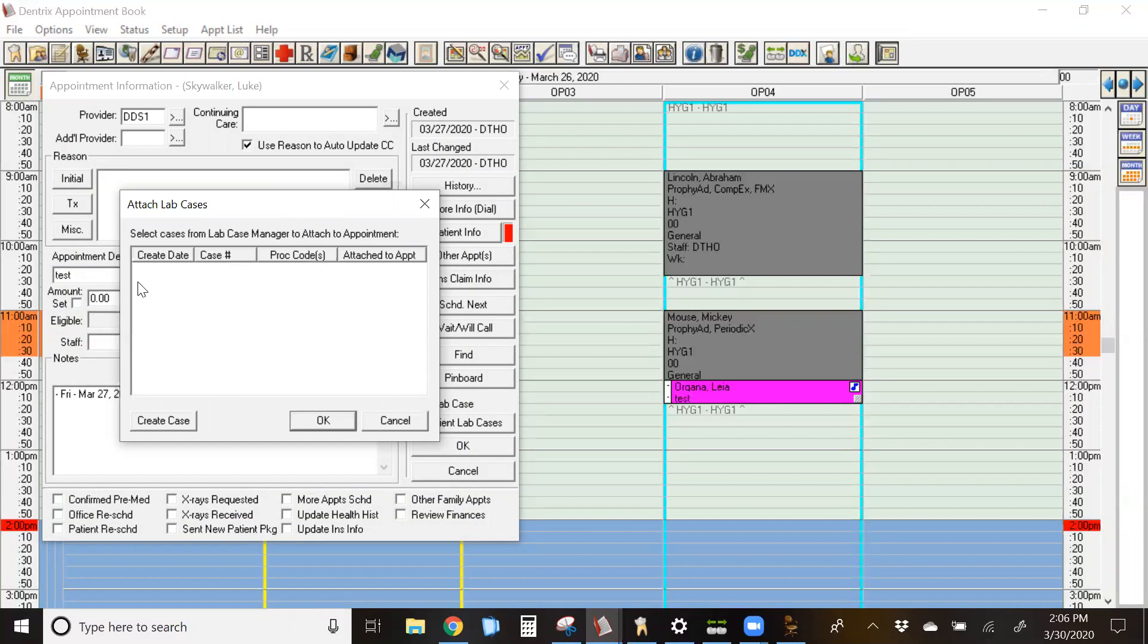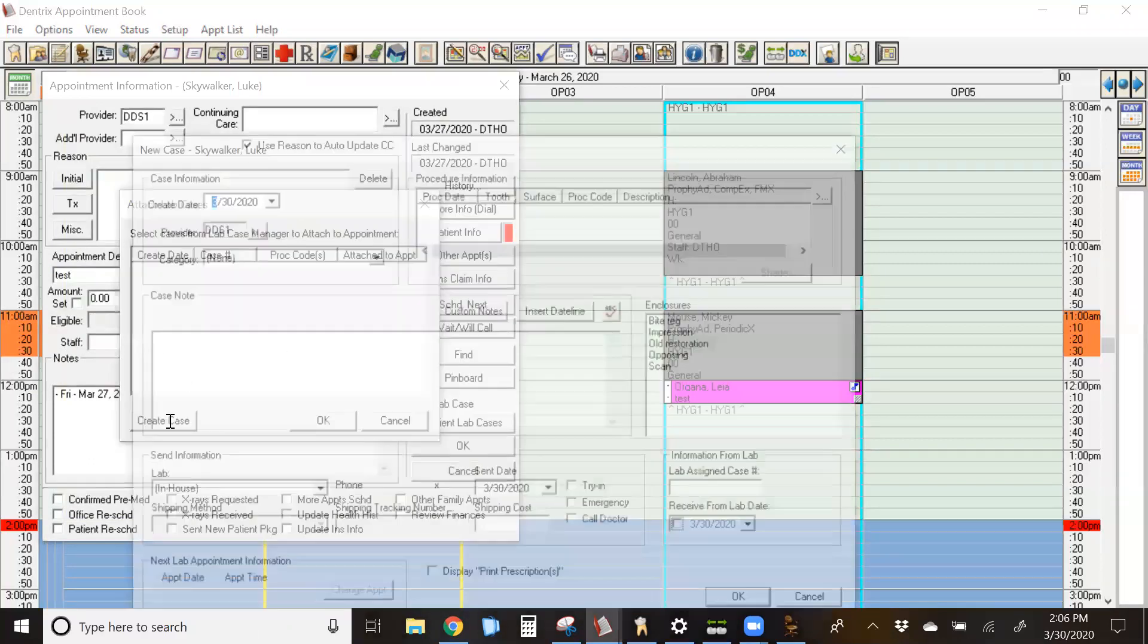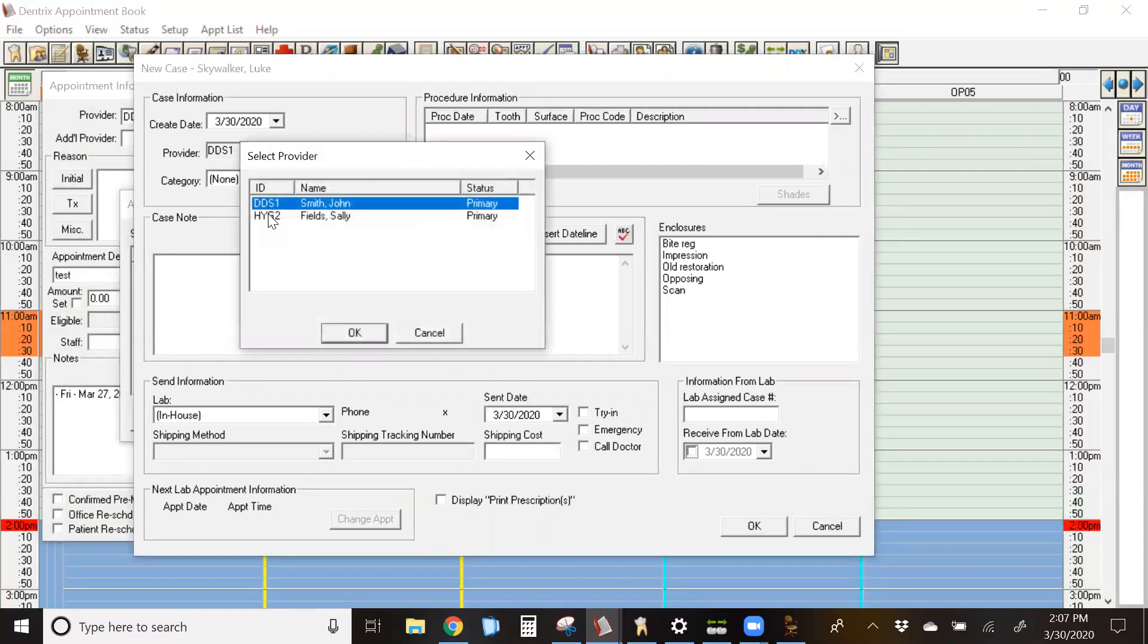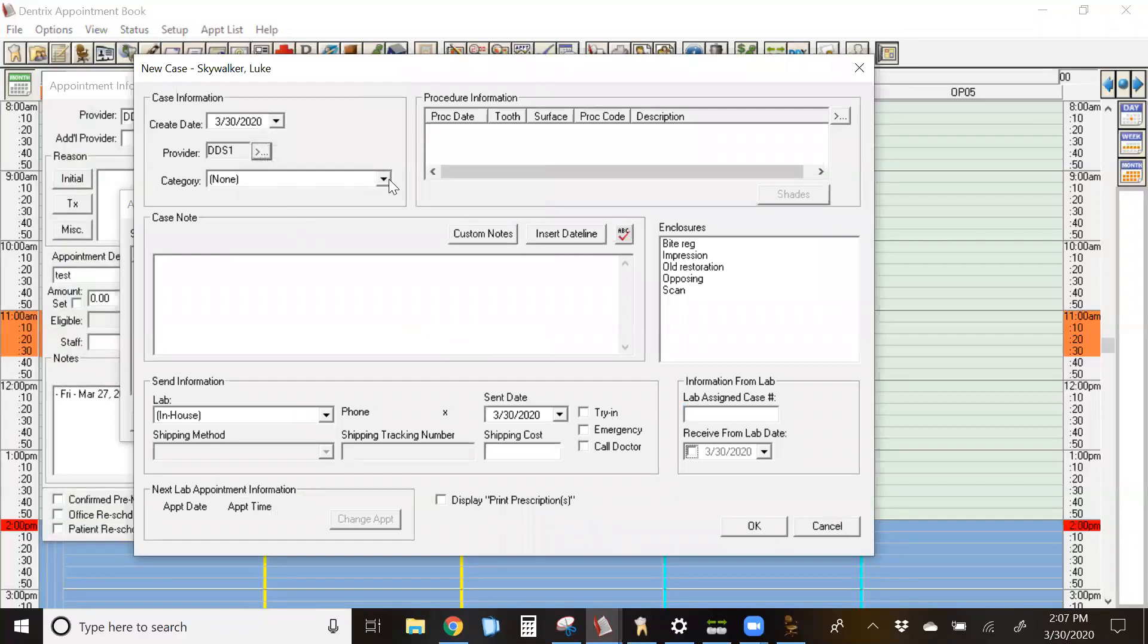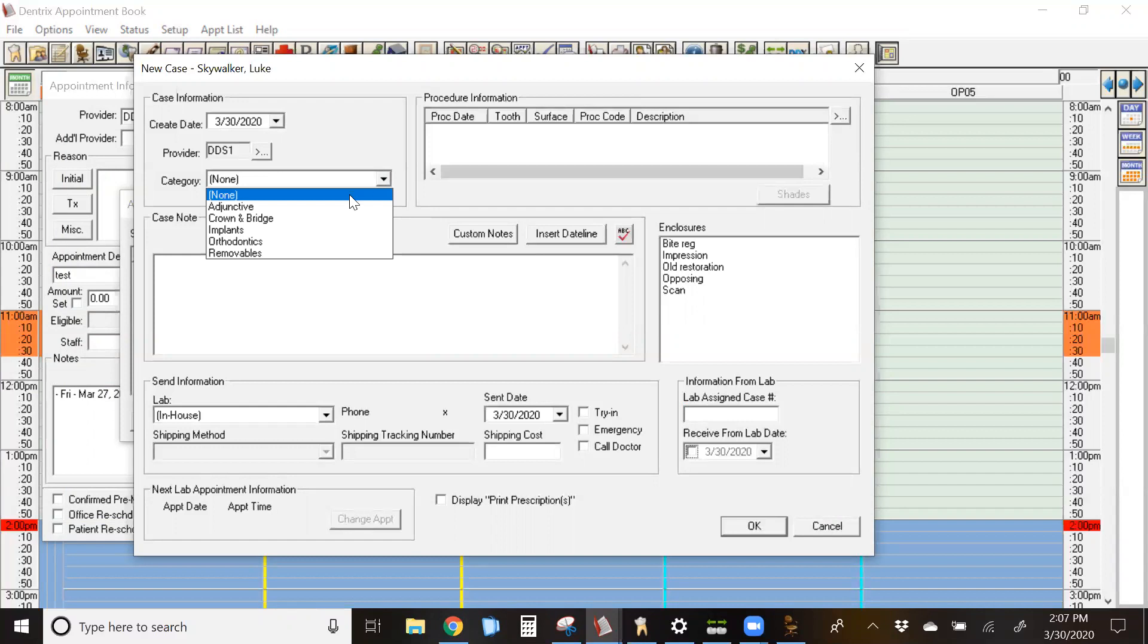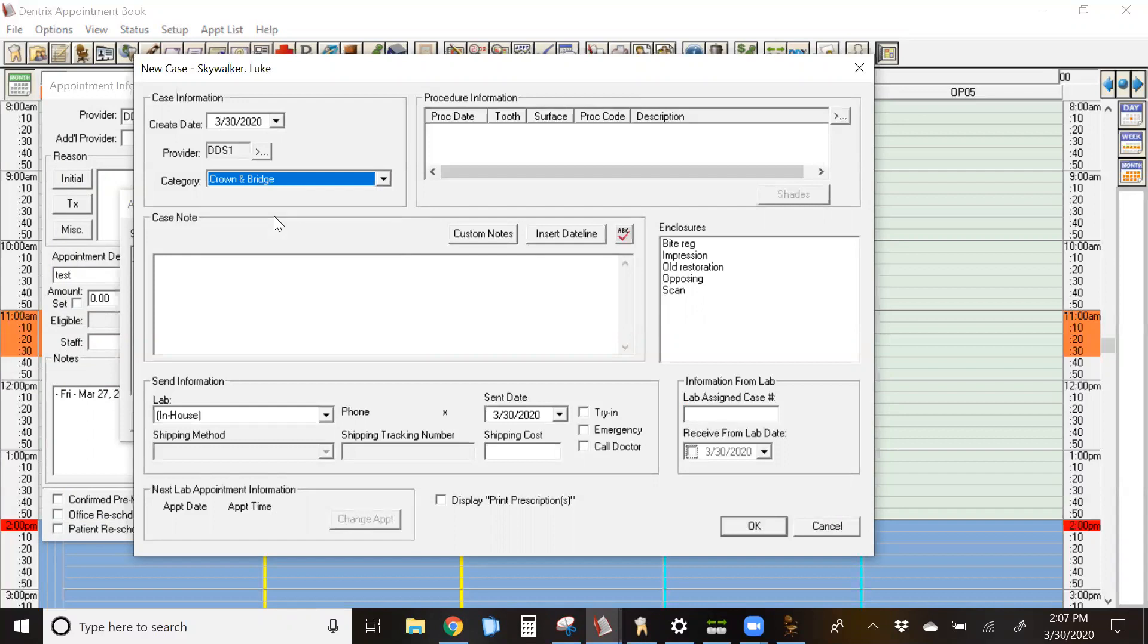From this screen, you're going to click on the lower left button, create case. It will default with today's date, the primary provider of the patient. However, you can switch to a different provider if you choose. Select the respective category that this falls under. Keep in mind that this is something that is blank when you first load Dentrix and does need to be set up by the practice, which I'll show you later in our session. This is a crown prep that we did today, so I'm going to select crown and bridge.